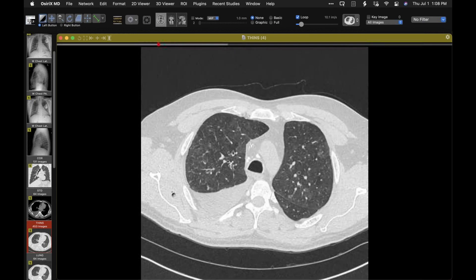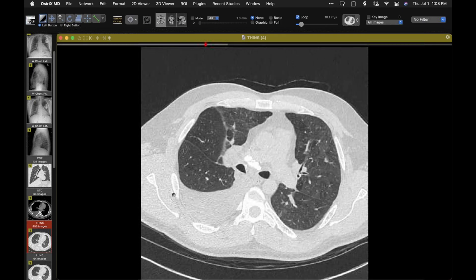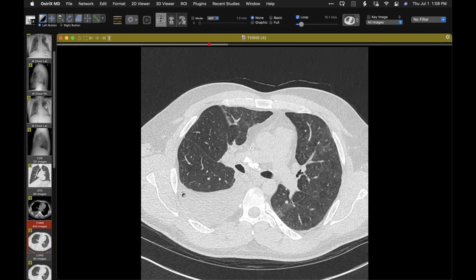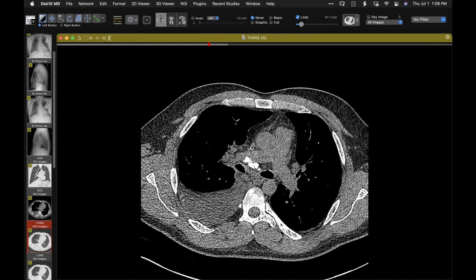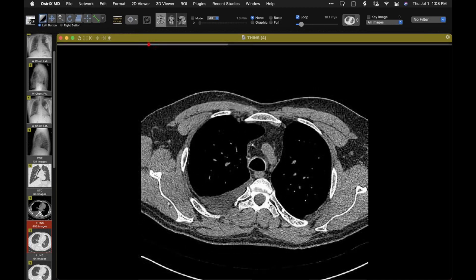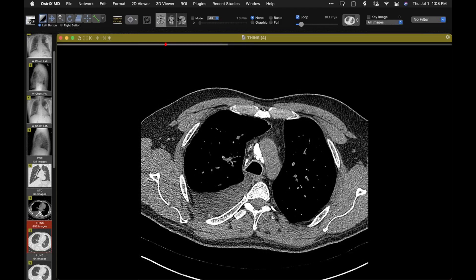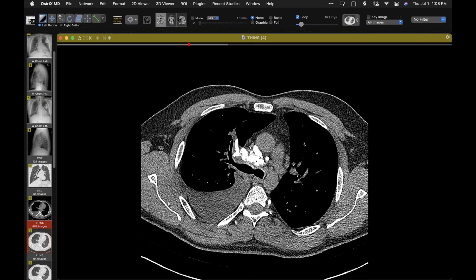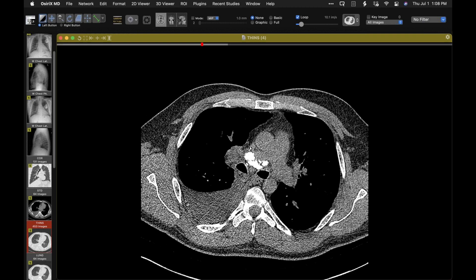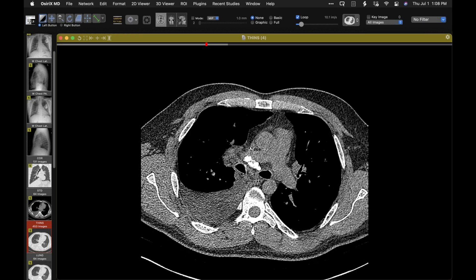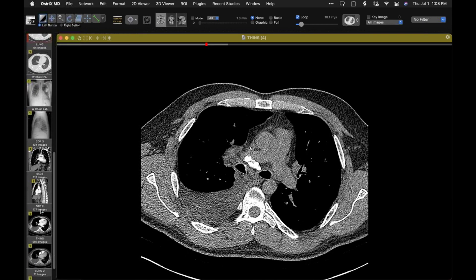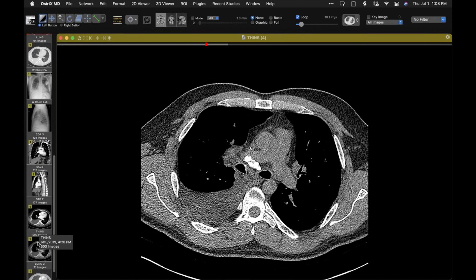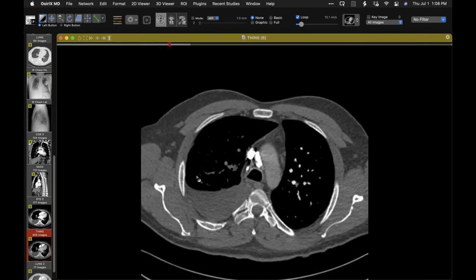Now I don't know whether he has a cause for left atrial hypertension, but now we're going to take a look and see why the edema is asymmetric. These are noisy images, but let me go from here down. We have a lot of calcification within right paratracheal mediastinal lymph nodes, pre-carinal a lot, and then when we get here in particular we'll see there's soft tissue opacity in the right suprahilar region as well.